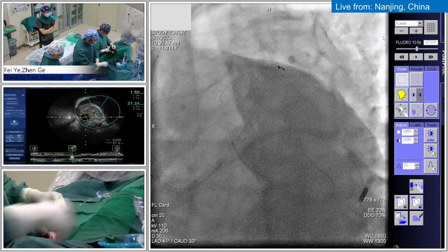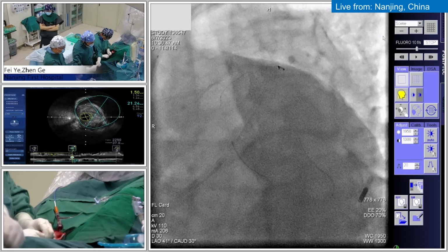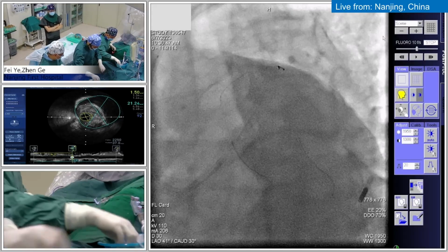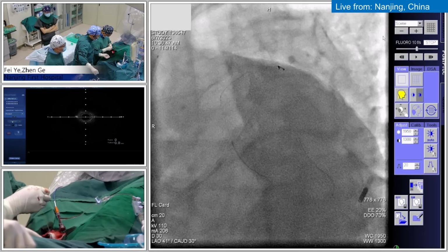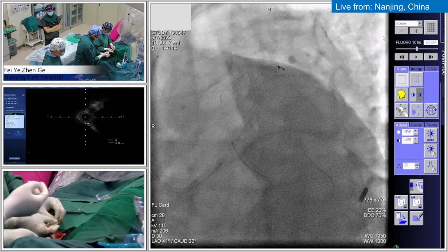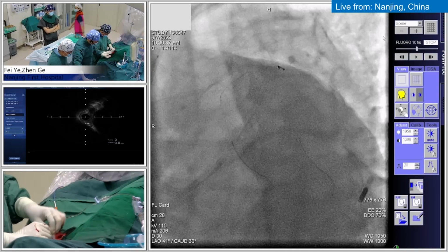So another question: do you want to stent now or check the IVUS? Yeah, I want to check IVUS. Yes, check the IVUS. We will see your preparation result after 2 NC balloons and 1 scoring balloon. Flush the IVUS catheter, flush.